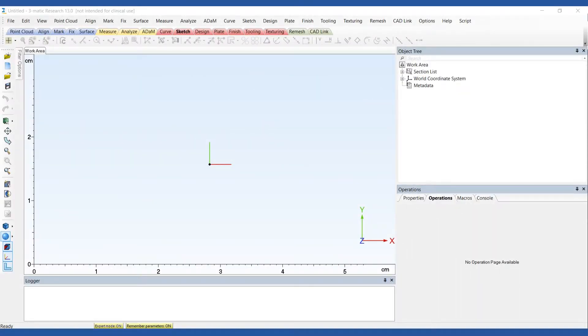Hello my name is Simon and I'm an application engineer at Materialise. In this video I'm going to show you how to create a customized cardiovascular benchtop model.